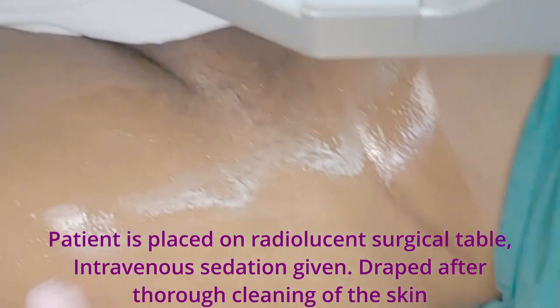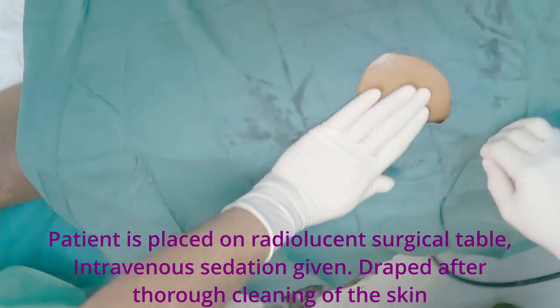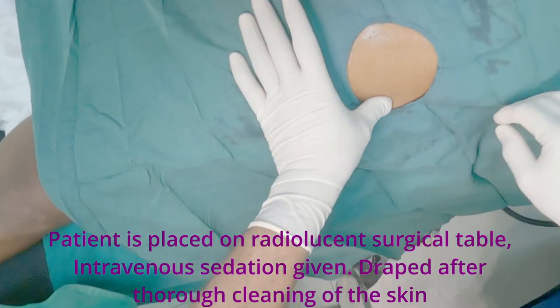The patient is placed on a radiolucent surgical table. Intravenous sedation is given and the area is draped after thorough cleaning of the skin.